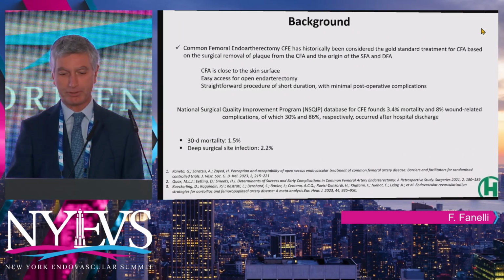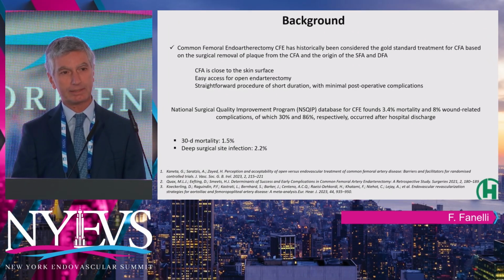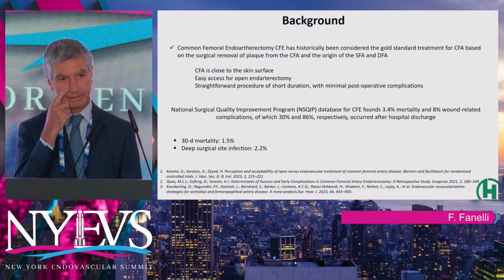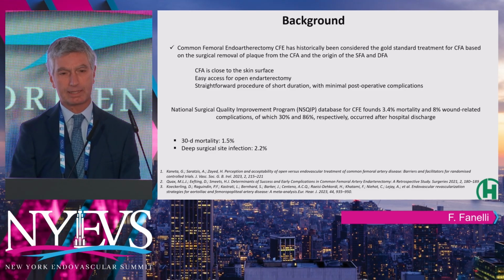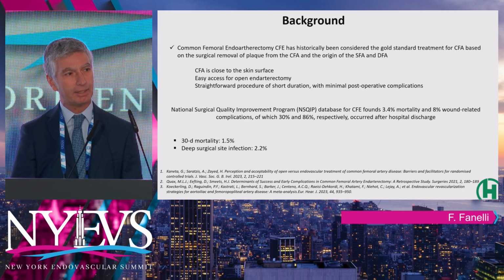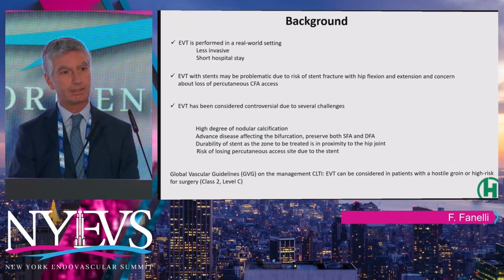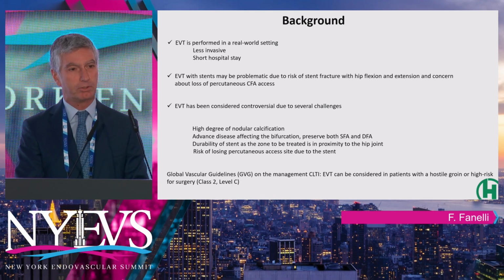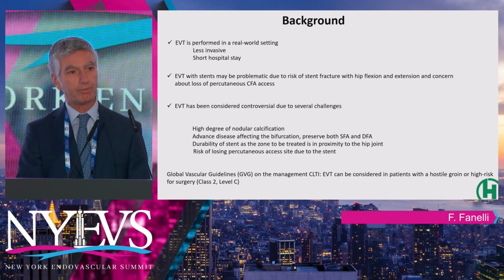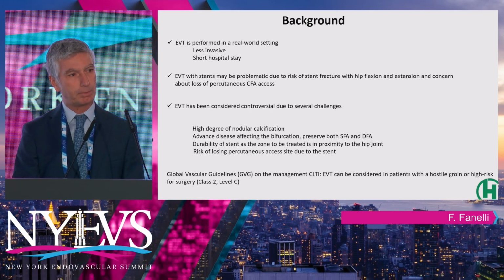Interesting topic, especially for the endovascular physician. We know that historically, the common femoral artery was treated by surgery. That was still considered the gold standard for many reasons, but in the last few years, we have observed a tremendous improvement of the technology and the techniques. So now we can also treat this area with endovascular procedures. There are still some drawbacks that we have to consider.